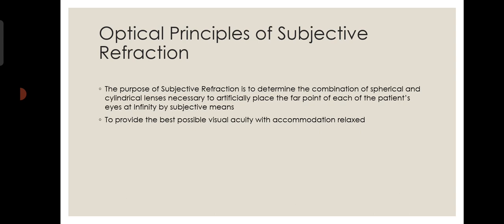Now, subjective refraction does not mean you are seeing something in the autorefractometer, putting it in the trial frame, trying and asking the patient whether this is better or that is better. It is not like that. Subjective refraction is a completely different concept. You need to give the patient adequate correction so that his accommodation is completely relaxed.